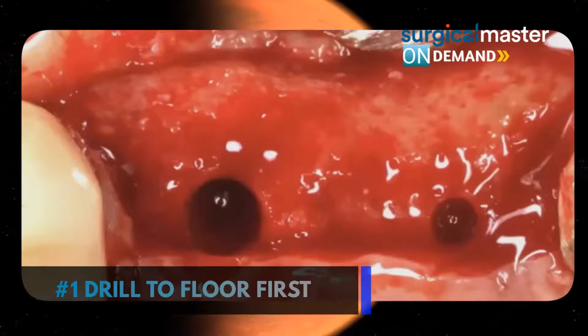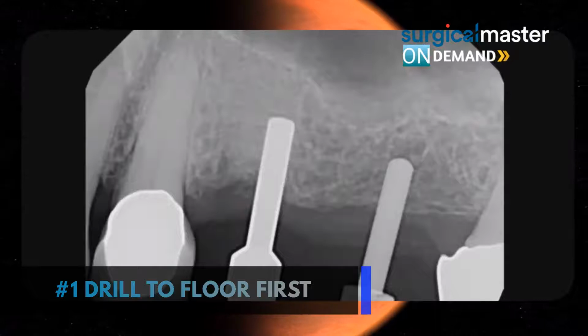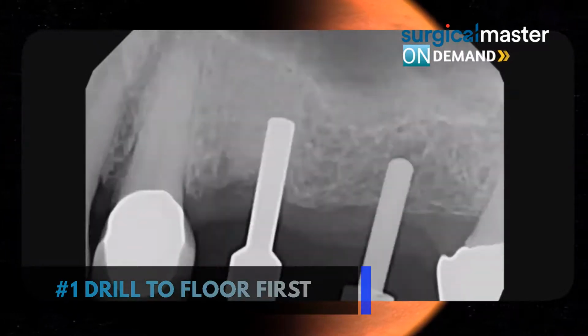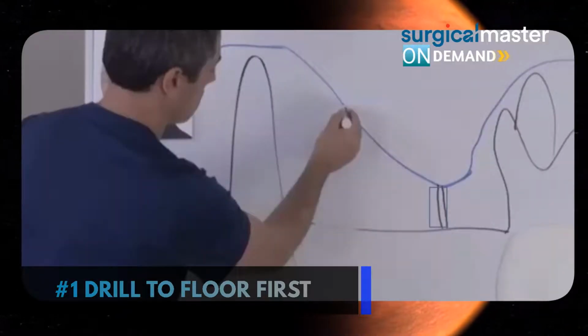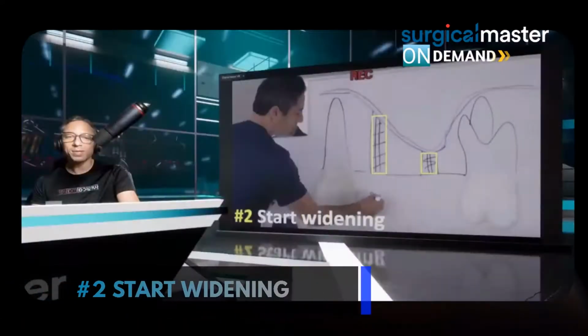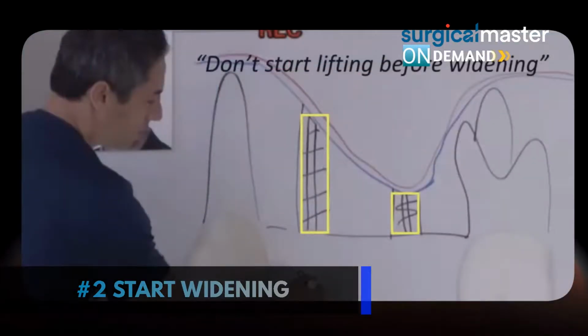Step number 1, drill to the floor first. That's your initial osteotomy. Remember the step, find the sinus floor. And when you find it, start your osteotomy. So I found the floor. It's right there. I'm starting to widen it. By the way, this is from one of our broadcasts. I felt like this was a pretty good illustration. Start the widening process to 4 millimeters.